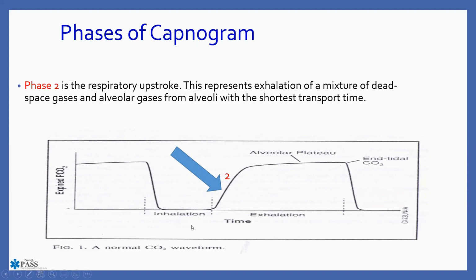Respiratory or anatomic dead space is the part that is in your trachea or maybe in your bronchus. As your patient starts to exhale, if you think about the very first breath, the first part of the breath that is coming out is really coming from your mouth. Then it comes from your trachea, and then from your bronchus. And then when you're almost to the very end of that exhalation, now you're actually getting down to where the gas exchange took place, the gas from all the way down in the alveoli. And that is why this waveform looks the way that it does.